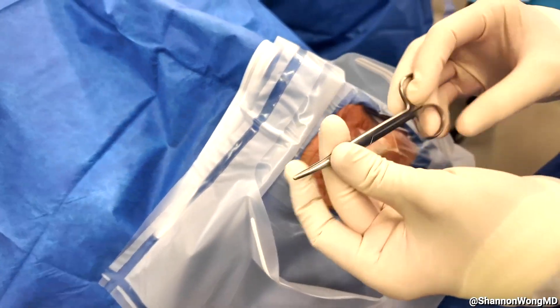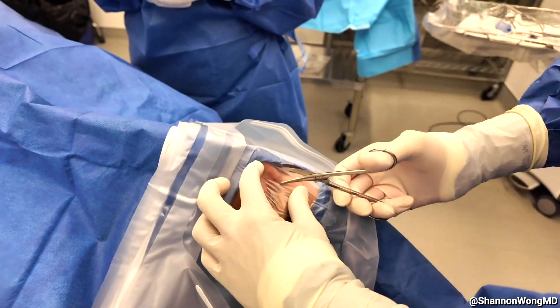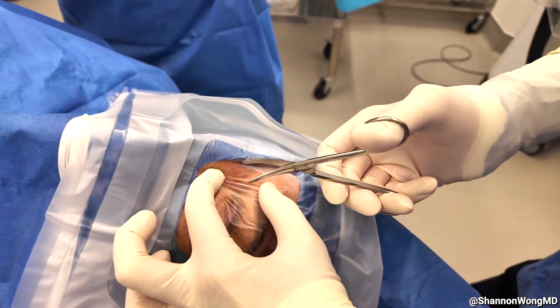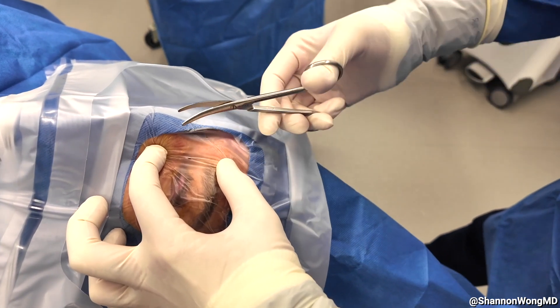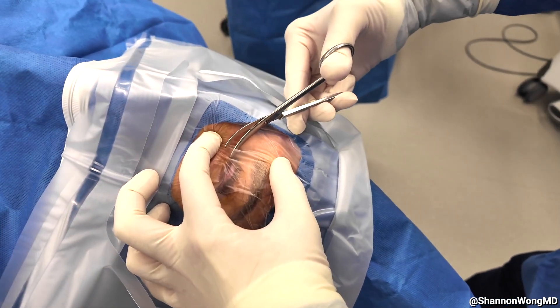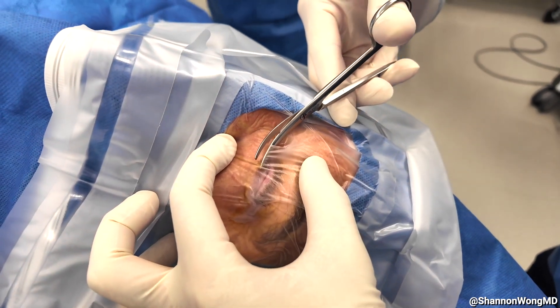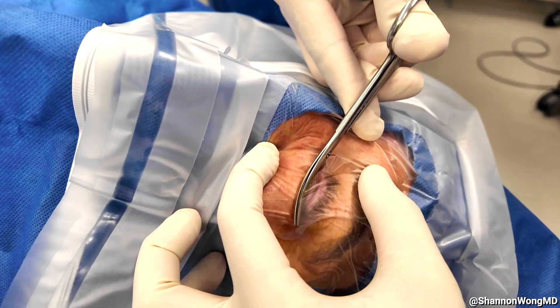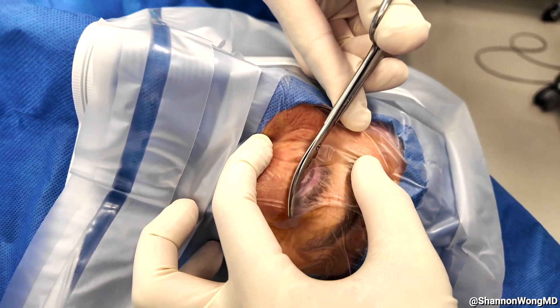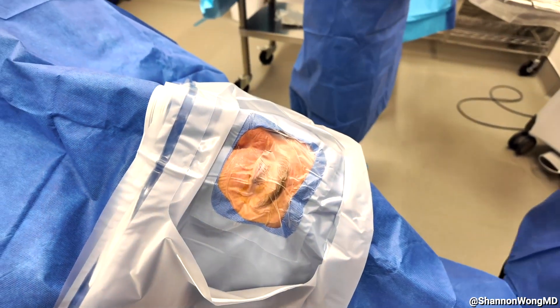Then we use our drape scissors to incise one vertical cut. The drape scissors are then directed to create a shelf of the plastic drape that will be used to fold the upper eyelashes backwards against the upper eyelid once we place the lid speculum.